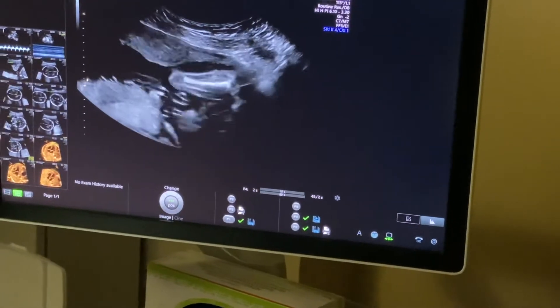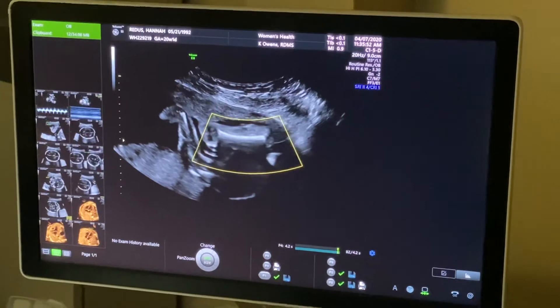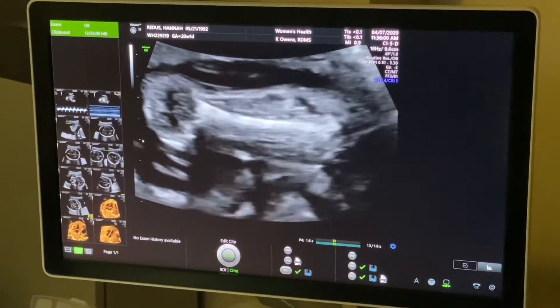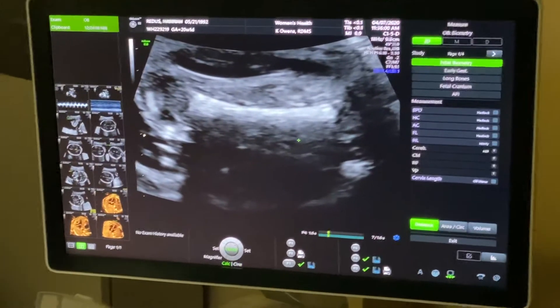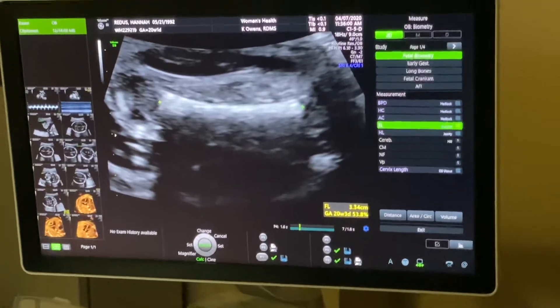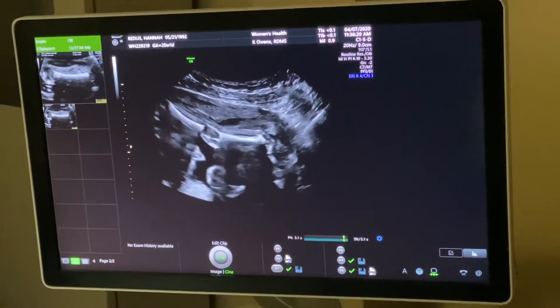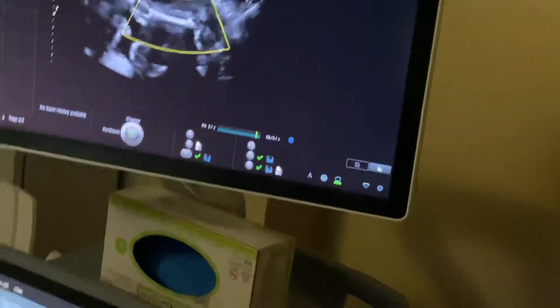Now that looks better. That's a nice, clear second. And so this is our femur. 3.34 centimeters — is that what that said? I look at what the measurement is. That's what baby's femur is.